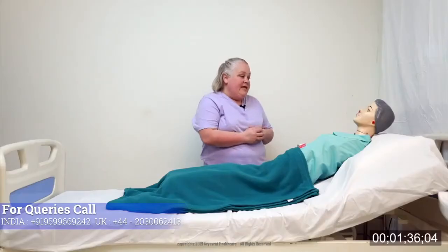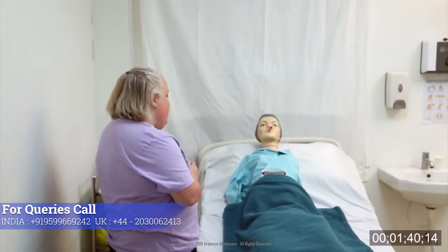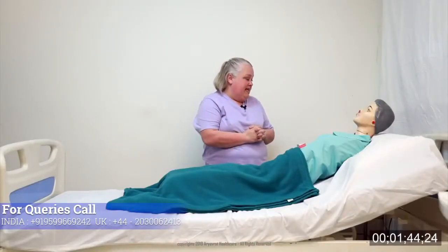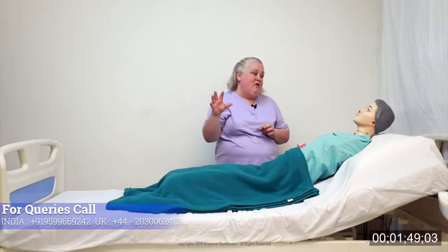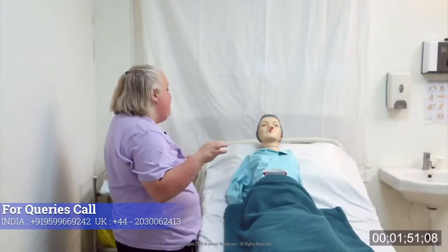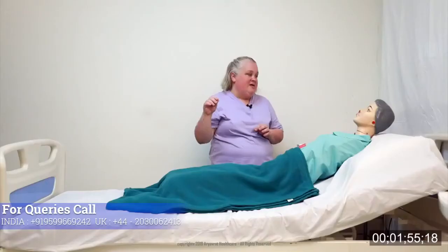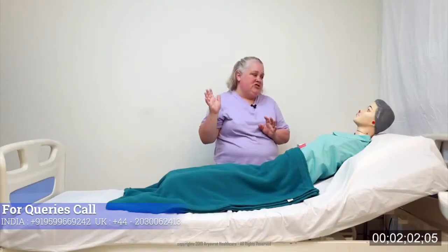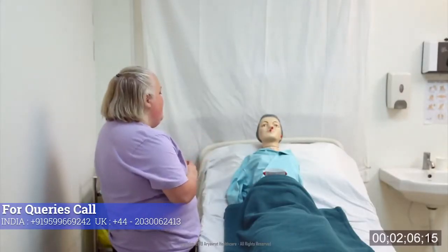Okay. I need to take your catheter out for a trial without catheter. Is that okay? Yes. Okay, so what that means is the tube that's in your bladder at the moment is held in by a balloon. So I need to deflate that balloon and just pull gently to remove the catheter. It does cause a little bit of a stinging sensation, but it doesn't actually hurt as much, and as soon as it's out it should resolve itself. Is that okay? Oh, that's good.